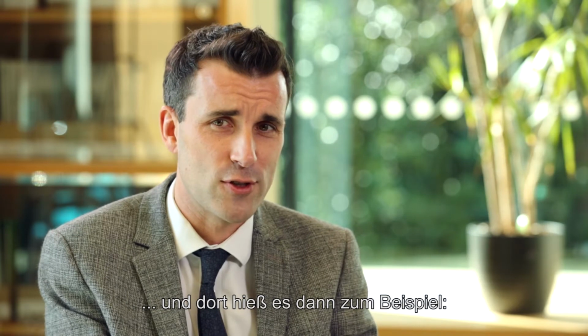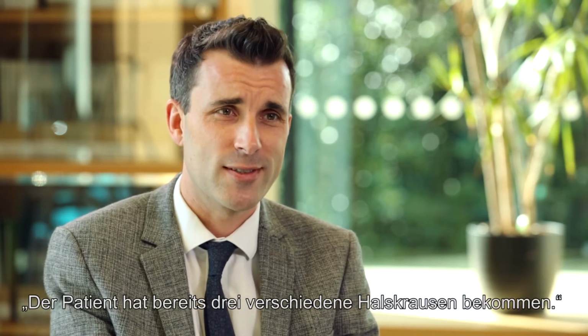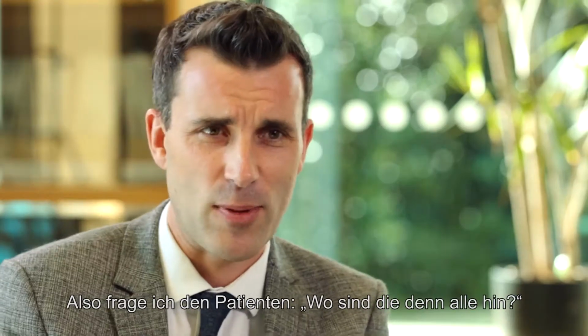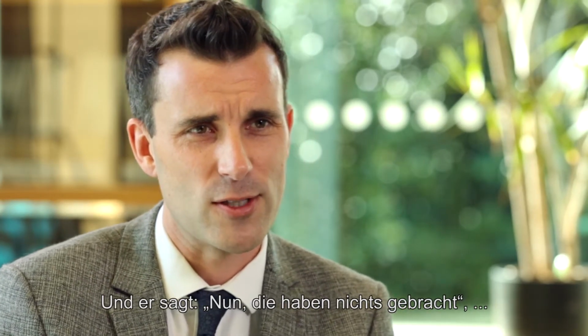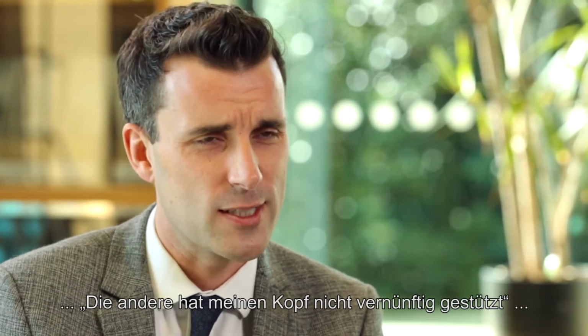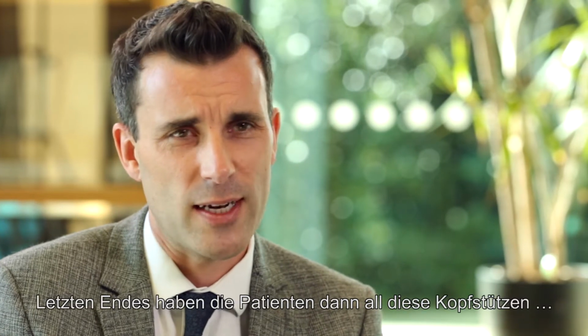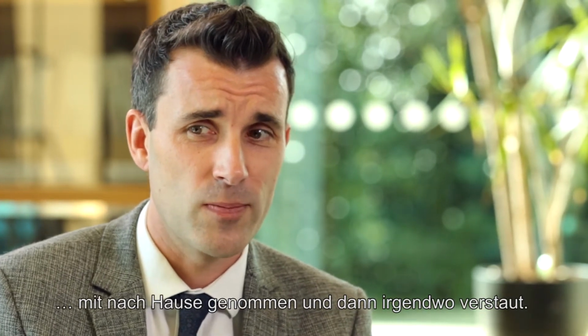Patients would come to me, they'd have this problem with their head drop, and we'd go and see the physio together, and the physiotherapist would say, well, I've already given this patient 3 collars. I'd ask the patient, where are all these collars? And she said, well, they don't work. I didn't like that one because it was too hard. I didn't like this one because it offered no support or it dug in. And really, the patients would take all the collars we'd given them, they would go home and put them in a drawer.